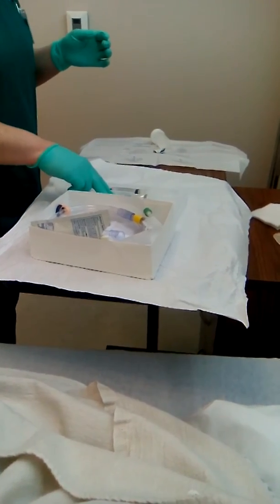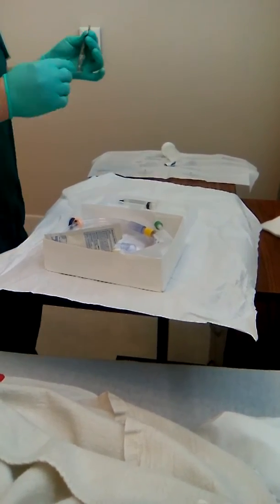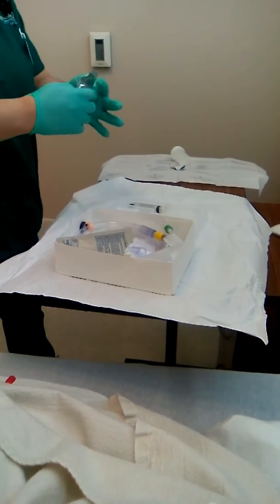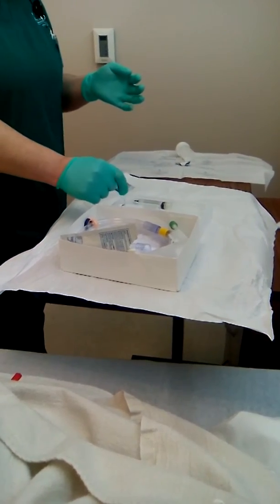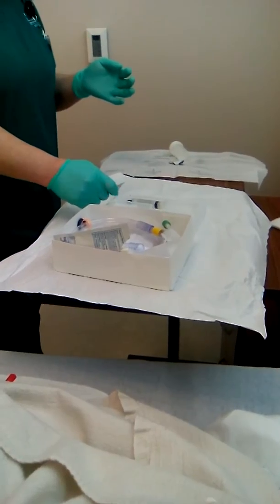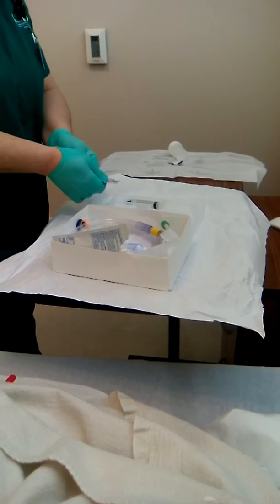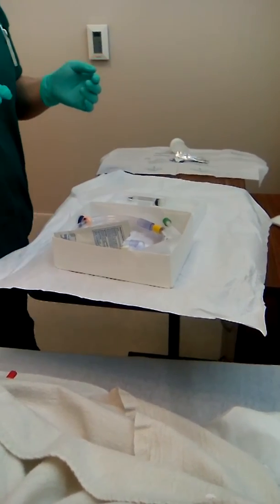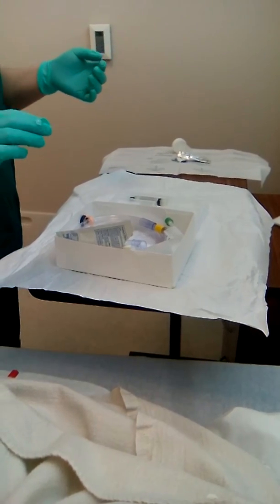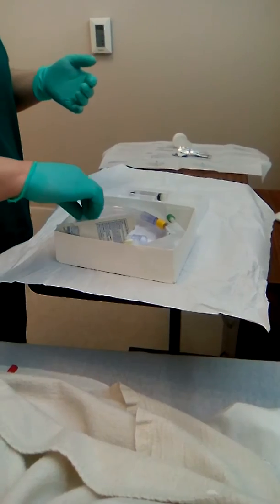I am going to open my lubrication. And dispose of. I will then take the inner wrapper off of my catheter.